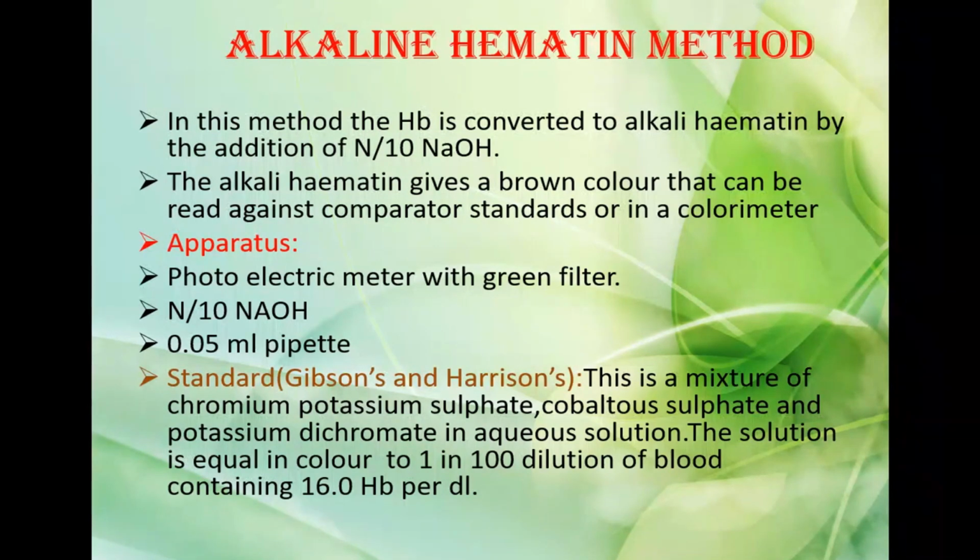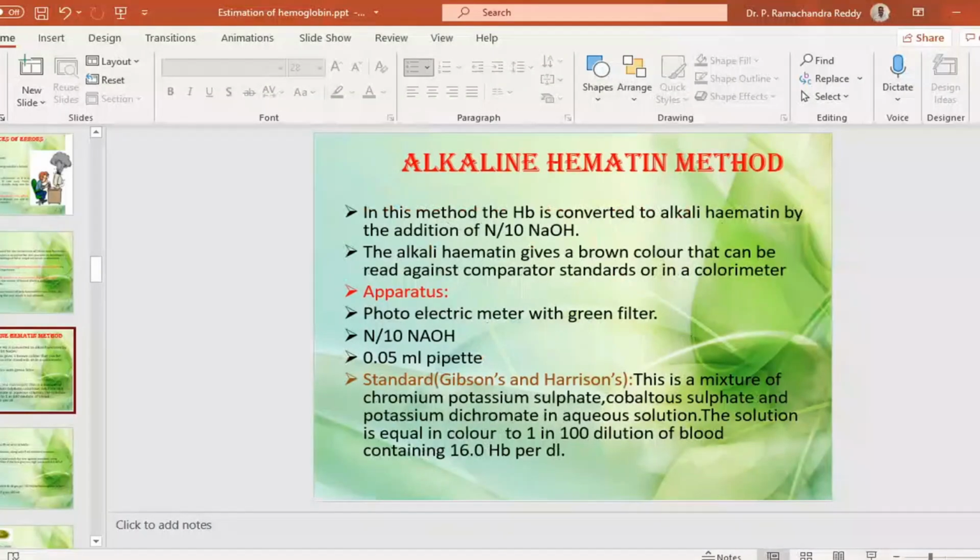So what do we require for this alkaline hematin method? We need a photoelectric meter with a green filter, and 0.1 N sodium hydroxide.